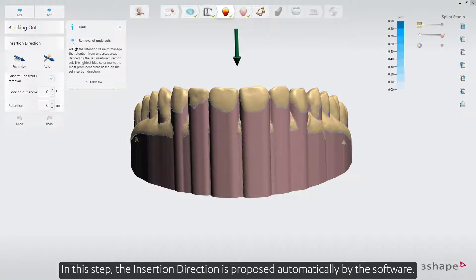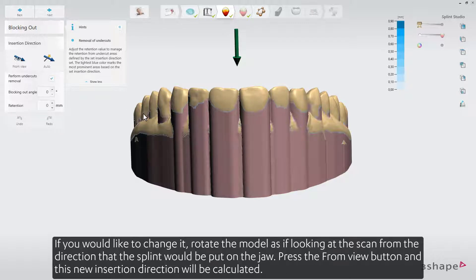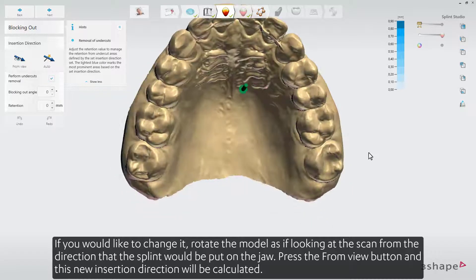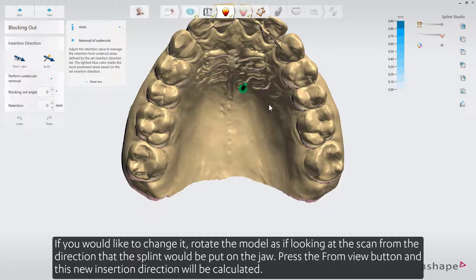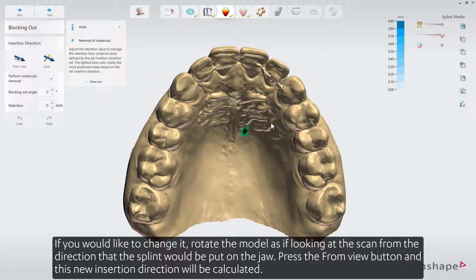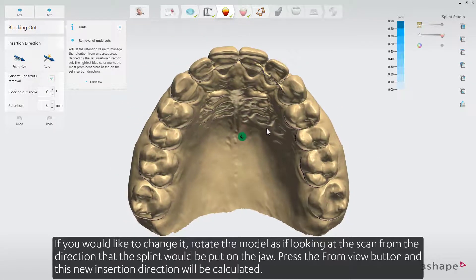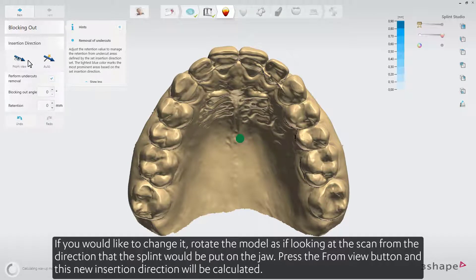In this step, the insertion direction is proposed automatically by the software. If you would like to change it, rotate the model as if looking at the scan from the direction that the splint would be put on the jaw. Press the From View button, and this new insertion direction will be calculated.